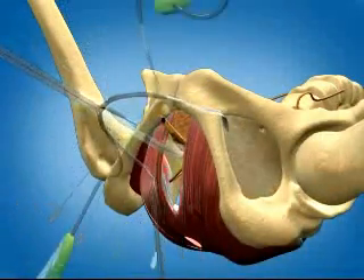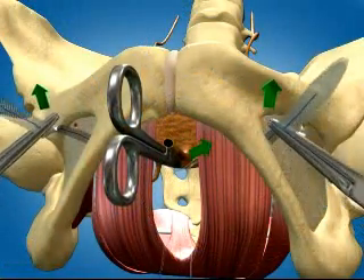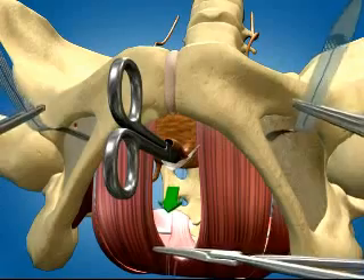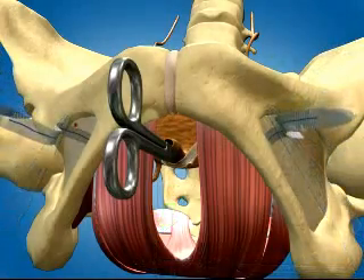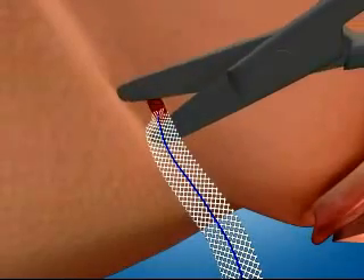Cut away needle and connector and repeat steps on patient's right side. Position the mesh under the urethra. The tensioning suture allows for intraoperative tension refinement without distorting the biologic graft. Once positioning is achieved, remove plastic sheaths, trim the mesh at subcutaneous level, and close the skin incisions.